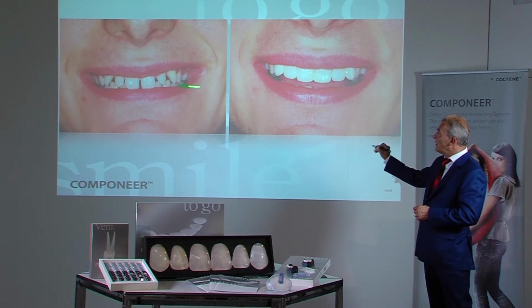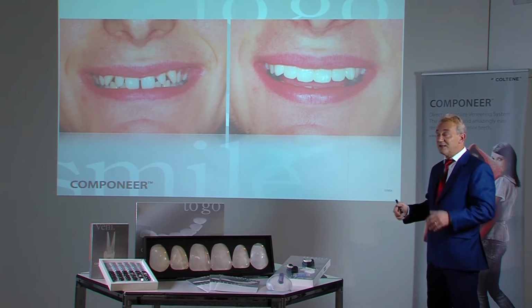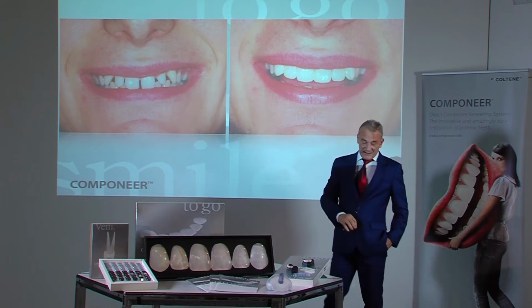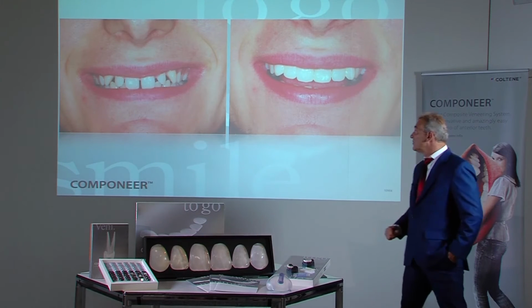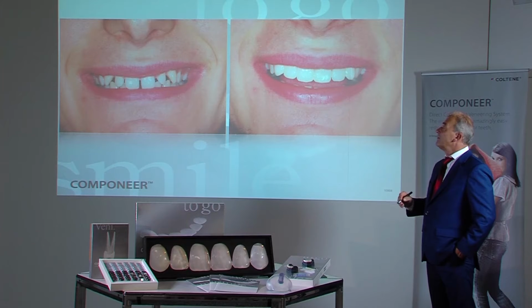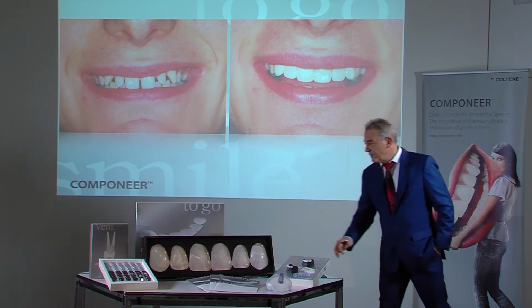Generally speaking, one always closes up to the center. The same procedure is applied to the lateral incisors. If one closed both gaps of the 2, in other words from the 2 to the 1 and the gap from the 2 to the 3, then the 2 would be too wide. Therefore, the cuspid is built up palatal with dentine mass.